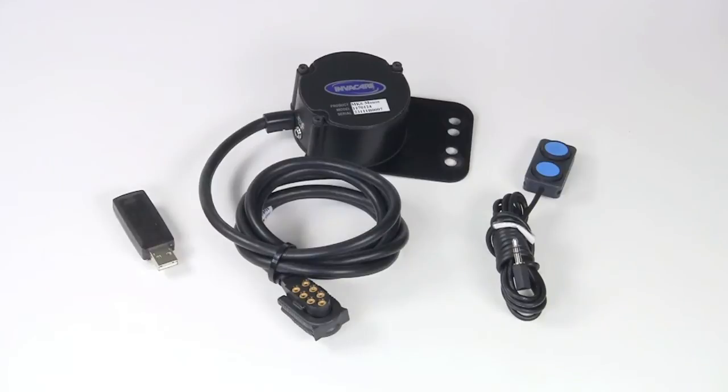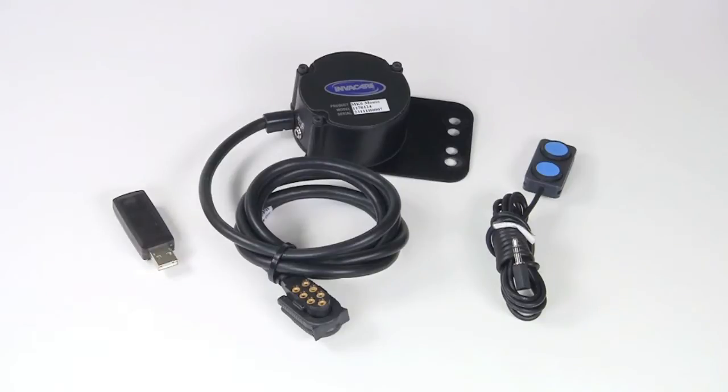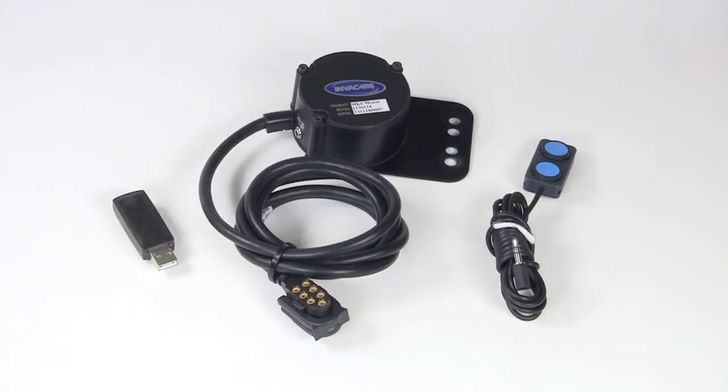Available as an on-chair configured item or off-chair through Invacare service parts, the RF mouse emulator, when ordered on-chair, will arrive with three main components for operation. First, the mouse module, which will be mounted to the wheelchair and connected to the Mark VI bus connection block.